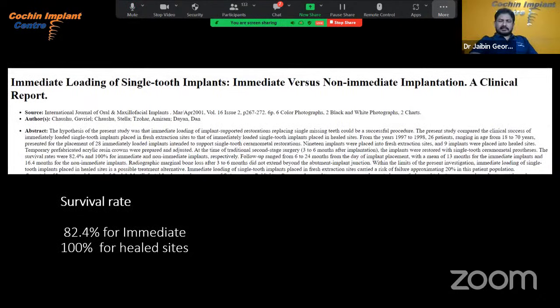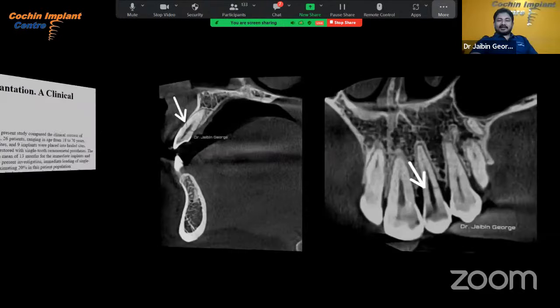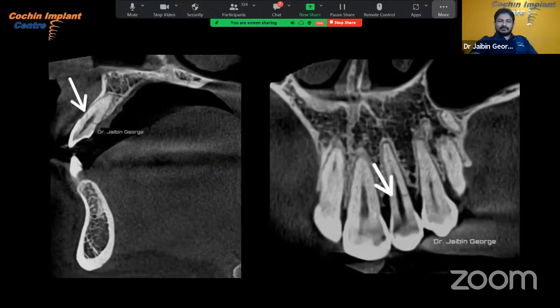In the literature, we see 82.4% of success for immediate placement and 100% success for healed sites. This is according to this study which was published. So I am sharing a case where the maxillary lateral incisor got fractured below the cervical level, where we plan to extract the tooth in a minimally invasive way, and place an implant and load it immediately.